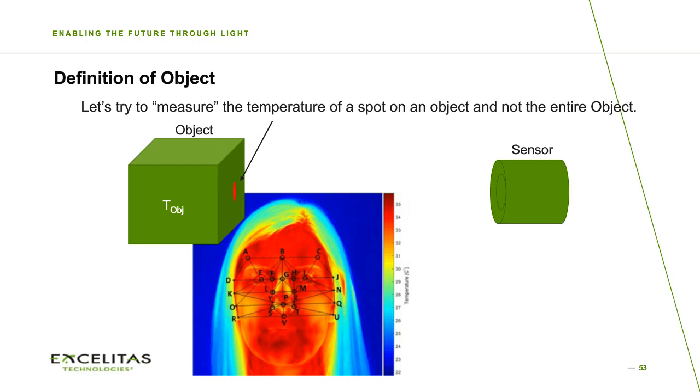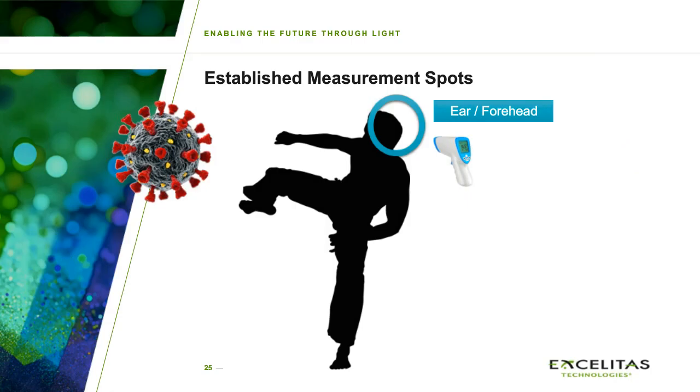So this distance dependence you can greatly reduce by having a long tube. When you look into those devices, I have shown a picture of this one, these pyrometers have a quite low distance dependence starting from several meters away. The biggest distance dependence you have from 0 to, let's say, 50 centimeters, and then it decreases less.